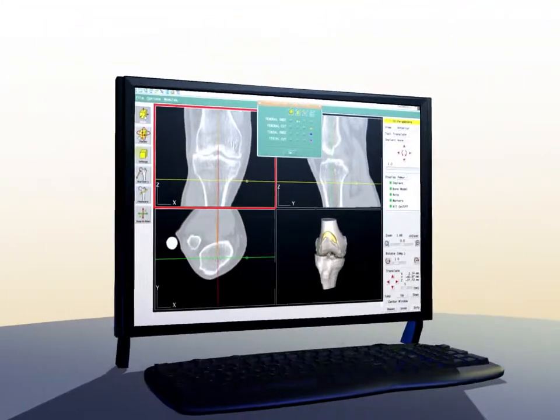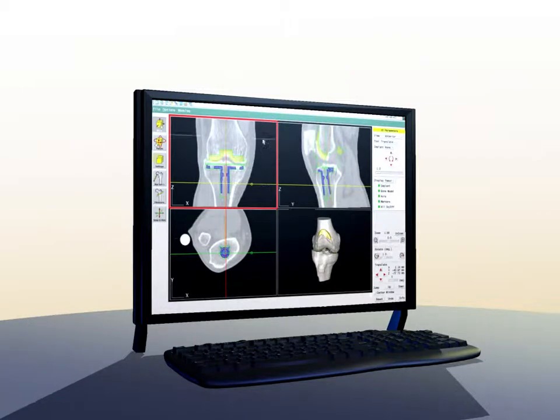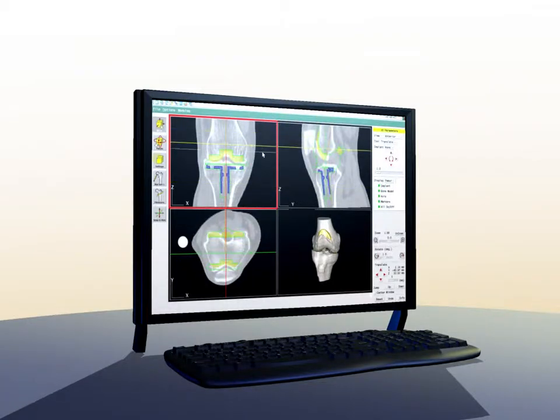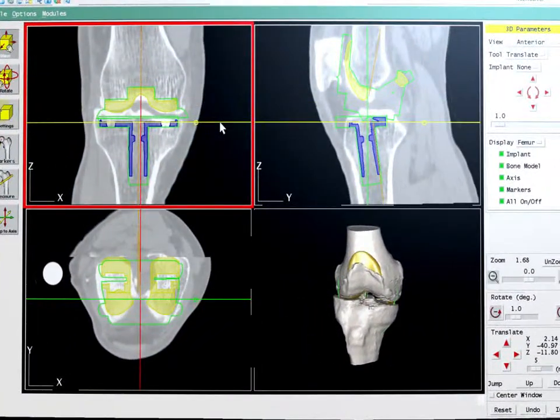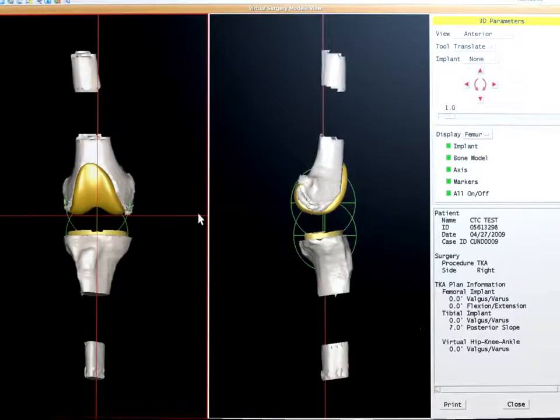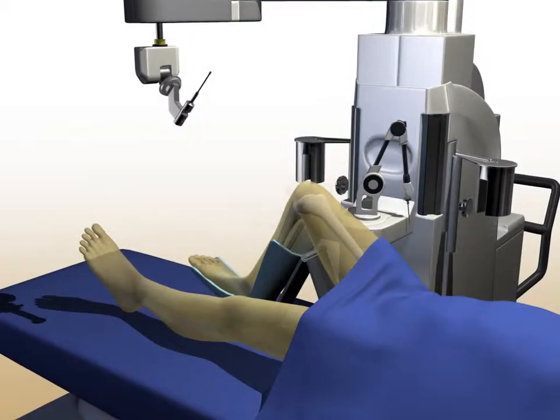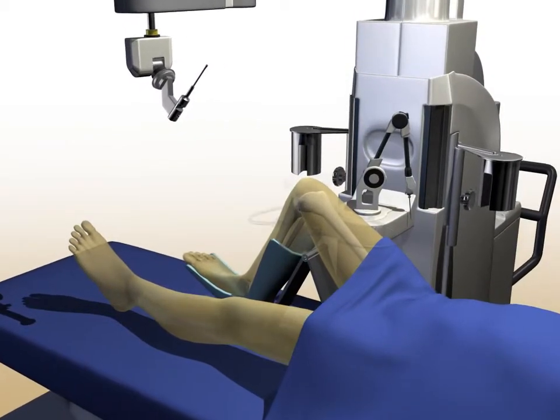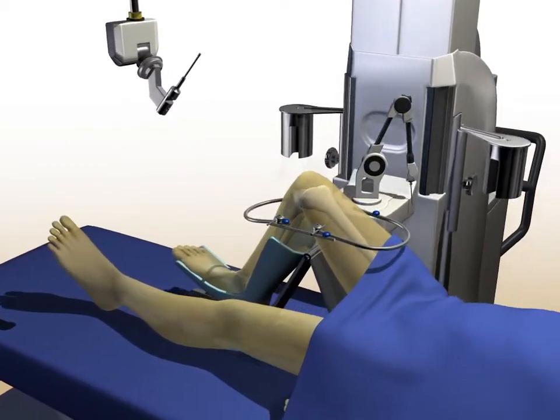The surgeon will select the implant type and size that best fits the patient. When the surgical plan is complete, it is uploaded to the RoboDoc surgical assistant. The patient is brought into the operating room, and the leg is prepared for surgery.